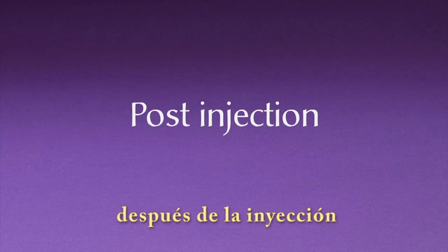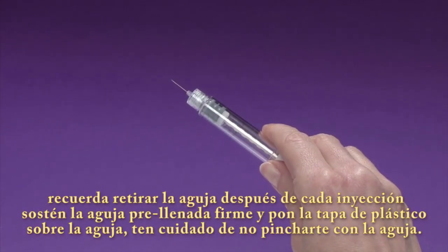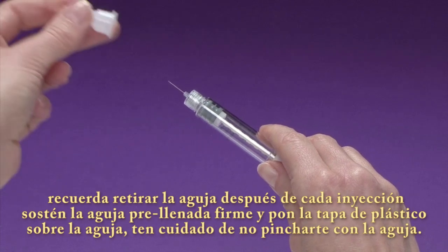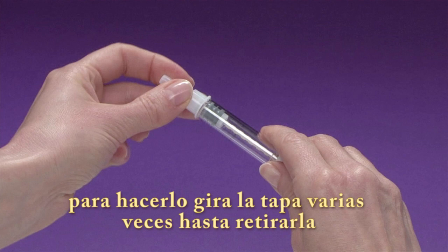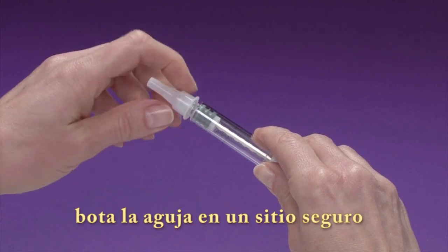Post-injection. Remember to take the needle off the pen after each injection. Hold the pre-filled pen firmly and carefully put the outer needle cap back onto the needle. Please be careful not to prick yourself with the needle. Once you have done this, grip the outer needle cap and unscrew the needle. Do this by turning it counterclockwise.